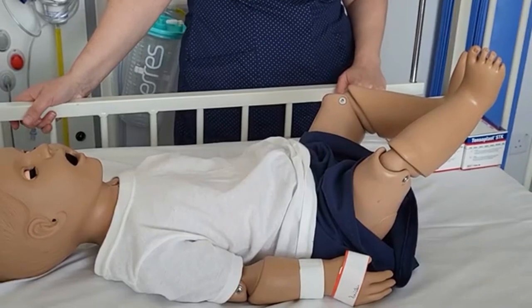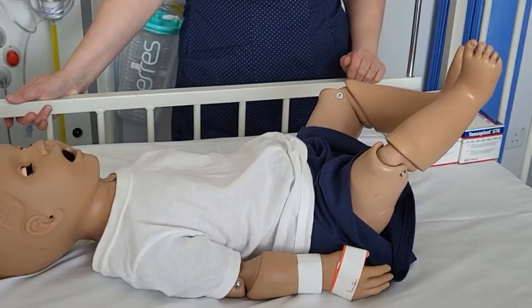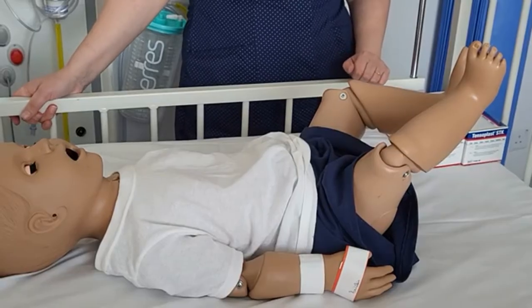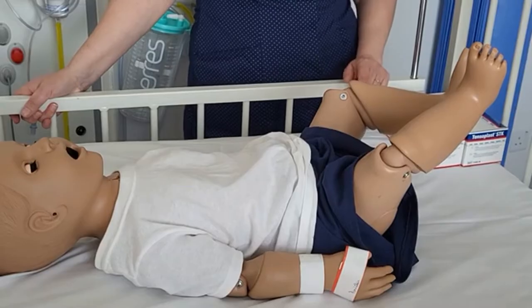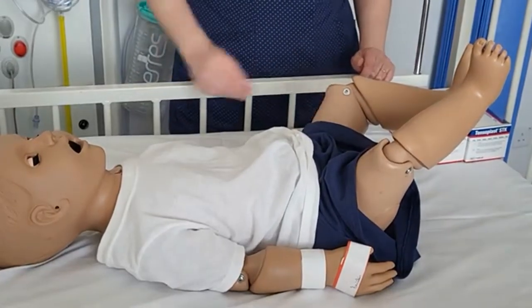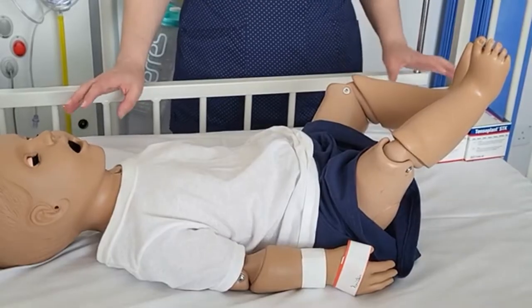How to prepare a child to go into gallows traction: your patient would be under 12 kilos to go into gallows traction, and you would need to ensure that they were adequately analgesed before the procedure — for example, a pain dose of paracetamol, ibuprofen, and Oromorph to be given at least half an hour before the procedure, and some diazepam for spasms. Children with fractured femurs get lots of muscle spasms, especially when you're putting on the traction. Once the child is comfortable and parents are aware of what's about to happen, we can then begin the procedure.